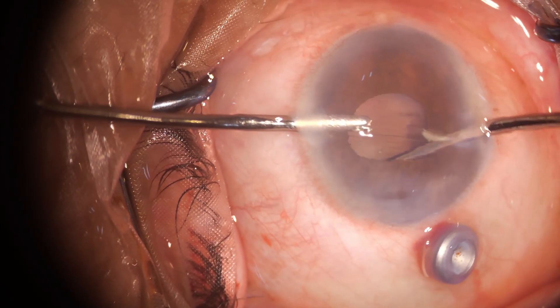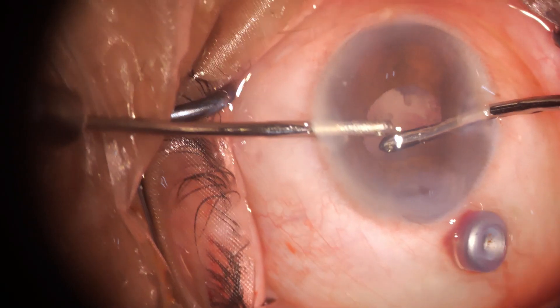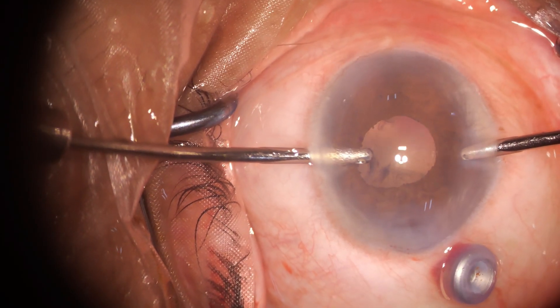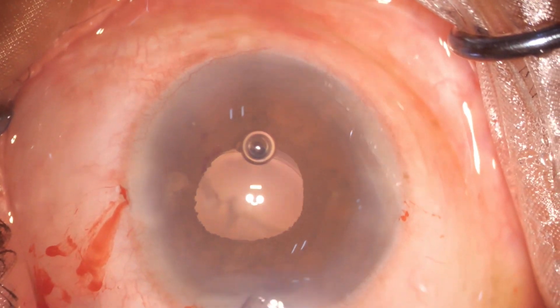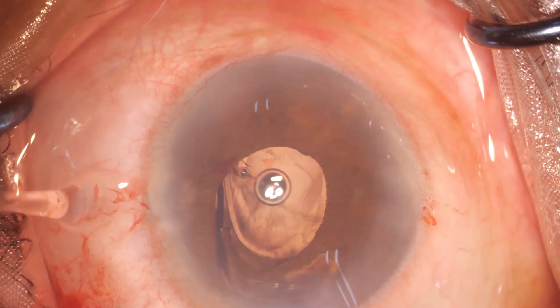Attempts are made to aspirate; however, the cortex is very, very sticky and you are very close to the posterior capsule at this point. So irrigation-aspiration is abandoned and the plan is changed — the lens is implanted to secure the eye well in the bag.